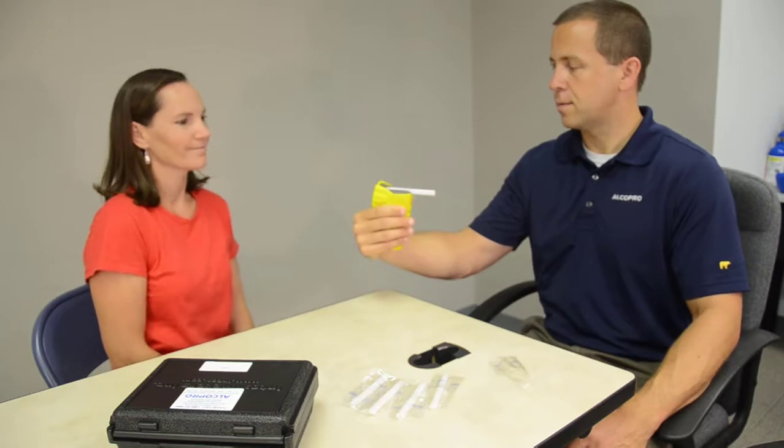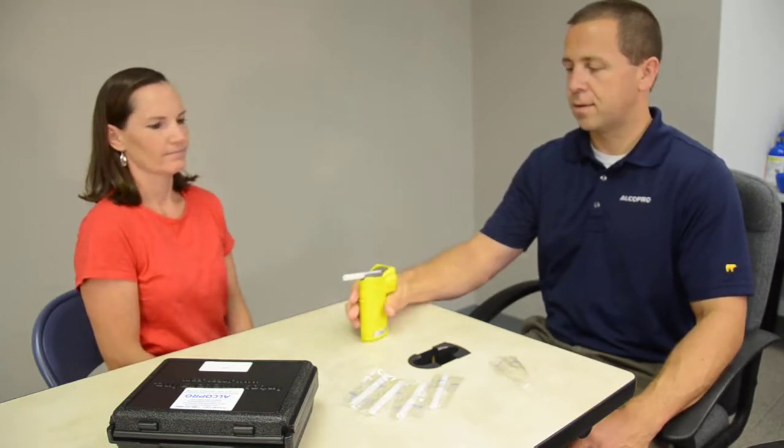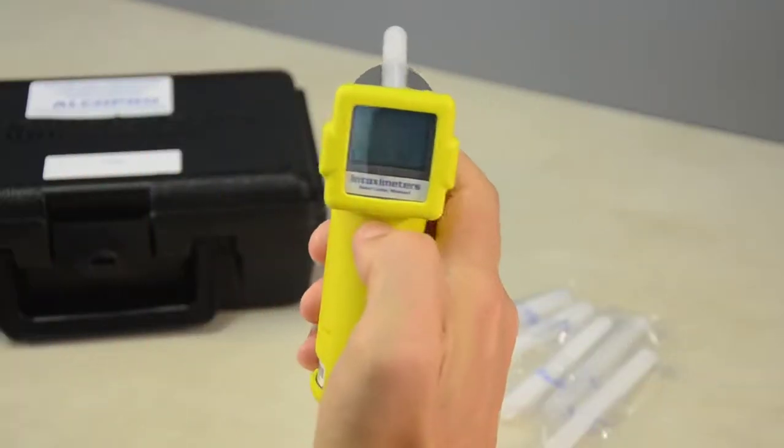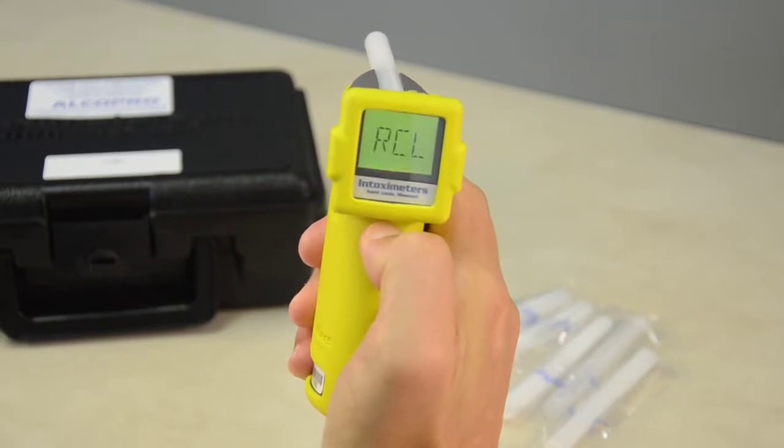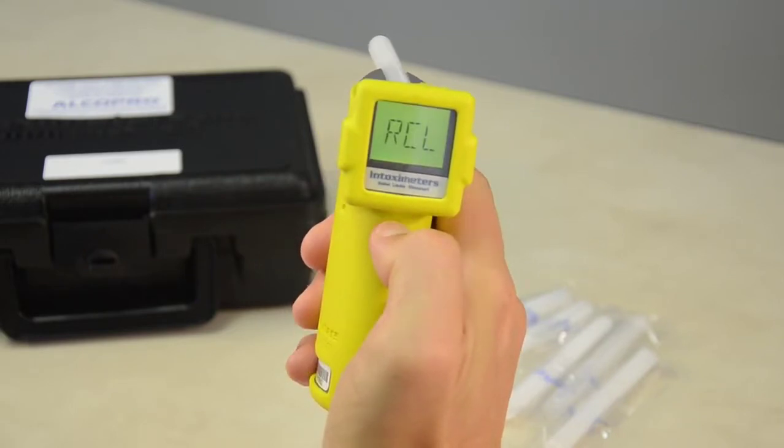To view the last test result after the instrument is powered off, use your thumb to press the OFF button, and then simultaneously press the ON button. The display will show RCL, which stands for Recall Last Test. Press the OFF button to display the last test result.